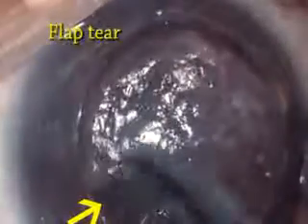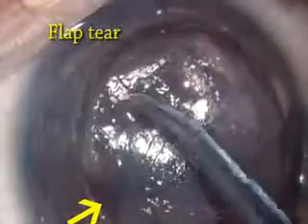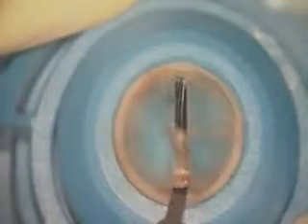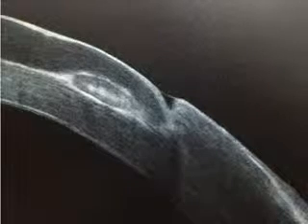Despite being a simple procedure, it does come with its own host of challenges. Inability to achieve the correct plane during dissection of donor tissue can lead to buttonhole, which will require taking a new tissue, as a buttonhole can act as a source of epithelial ingrowth. Imperfect apposition at the graft-host junction can lead to epithelial ingrowth, as shown in this picture, where the cells have grown into the interface between the graft and the host, as evidenced in this anterior segment OCT picture.